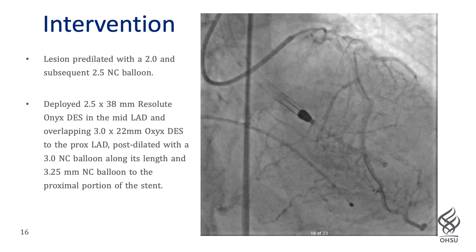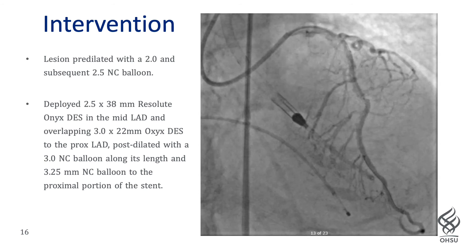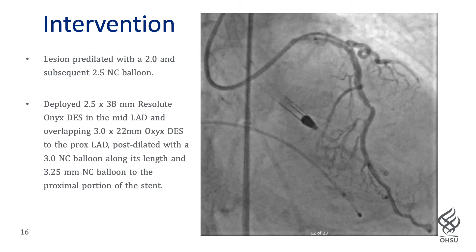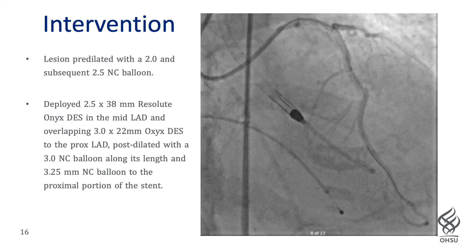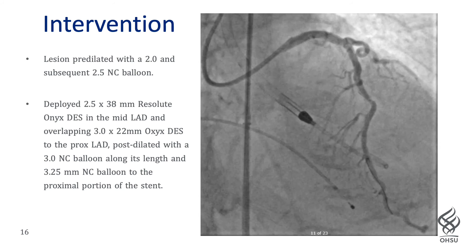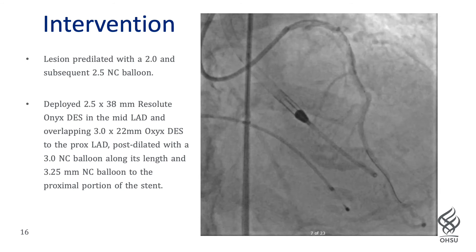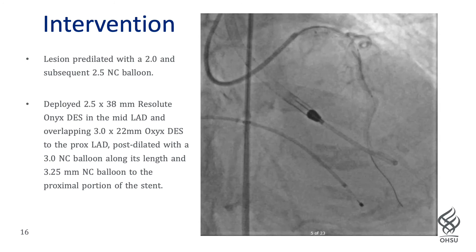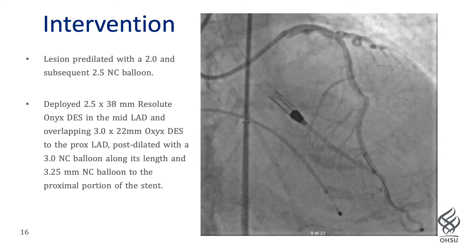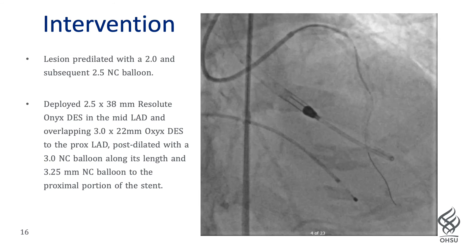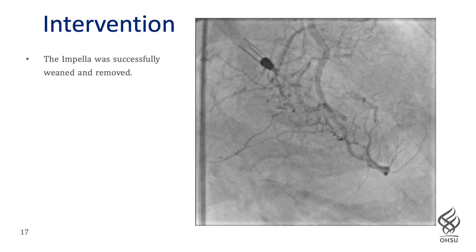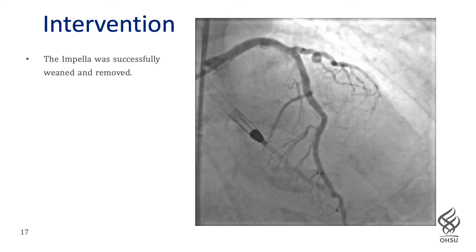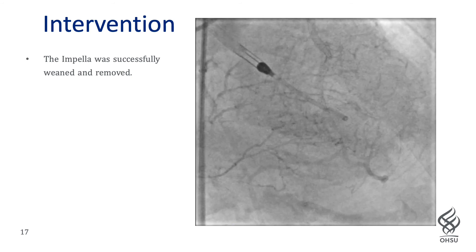The lesion was pre-dilated with a 2.0 and 2.5 NC balloon. Using angiographic sizing and considering the patient's small BMI of 19 and weight of 63 kilos, a 2.5 by 38 Resolute Onyx DES was placed in the mid-LAD, and a subsequent overlapping 3.0 by 22 Onyx DES was placed in the proximal LAD, post-dilated with a 3.0 NC balloon along its length and a 3.25 balloon more proximally. Completion angiography showed full stent expansion, conversion of the 70 to 80 percent stenosis to 0 percent with TIMI-3 flow, and no evidence of complication.